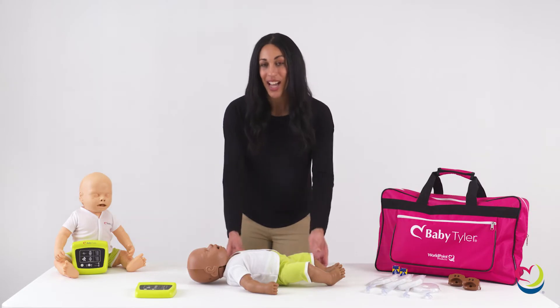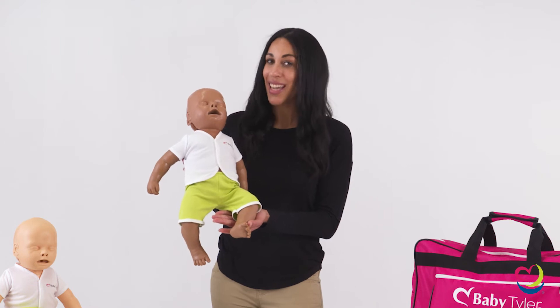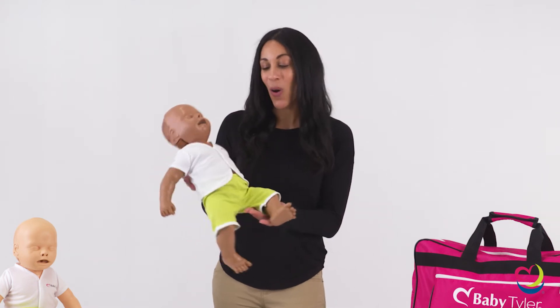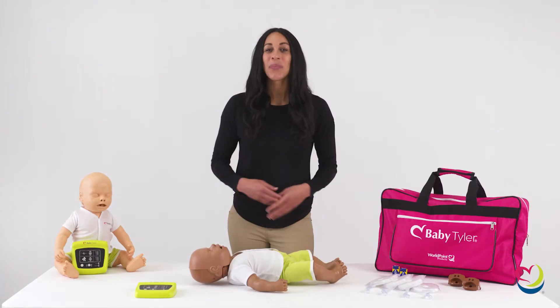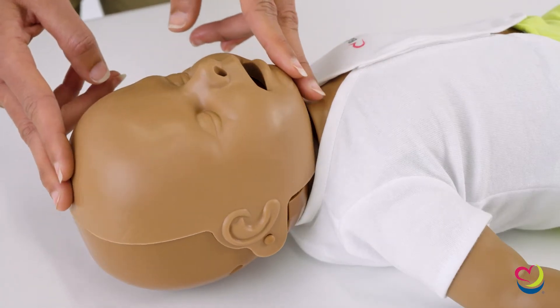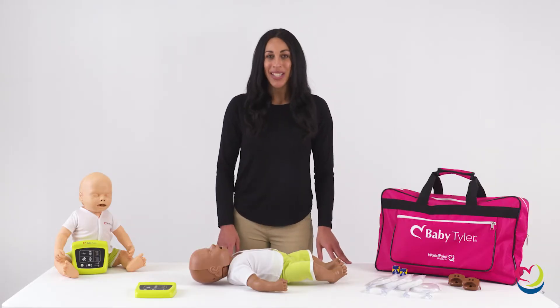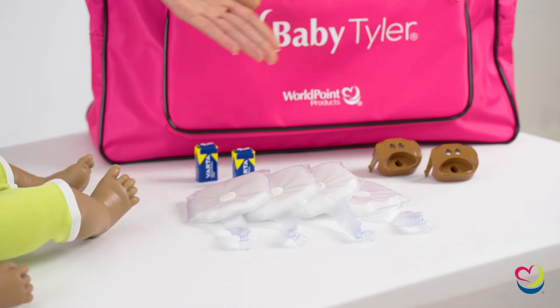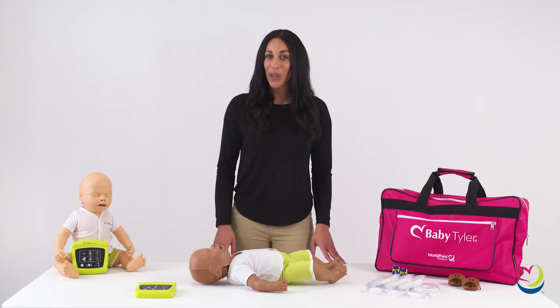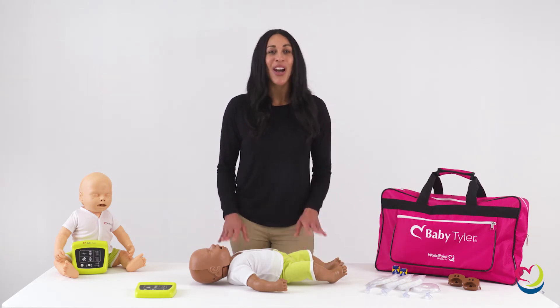Baby Tyler's size and movements are ideal for performing correct and realistic infant CPR, adapting to all training environments. Baby Tyler's realistic head tilt and chin lift allow you to practice realistic breathing. The high quality airway system consisting of a mouthpiece and a lung bag allows for hygienic training when paired with a CPR pocket mask or pediatric resuscitator. The mouthpiece can be fully disinfected and reused hundreds of times, saving you time and money.